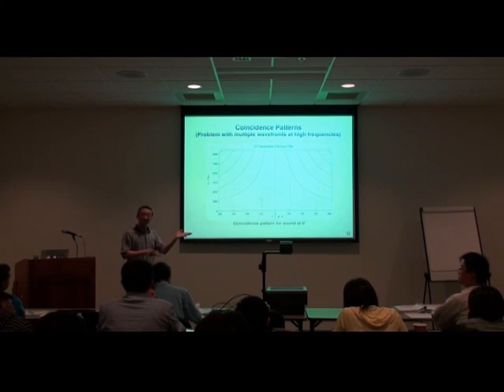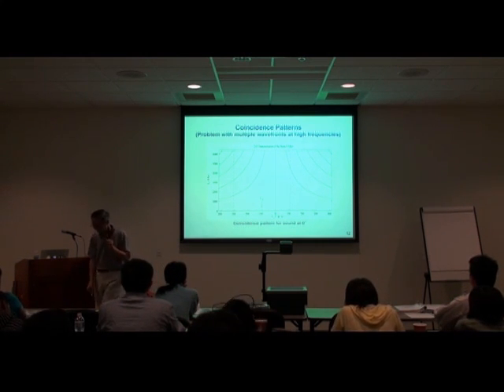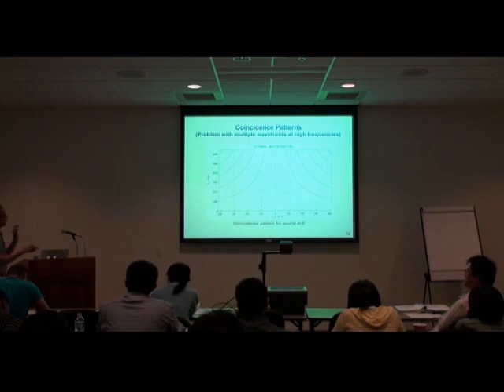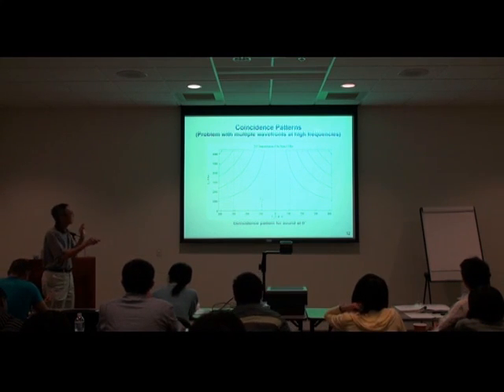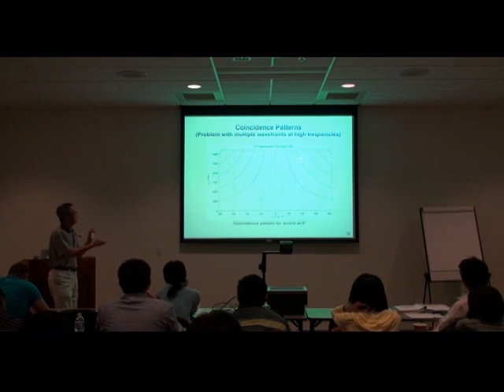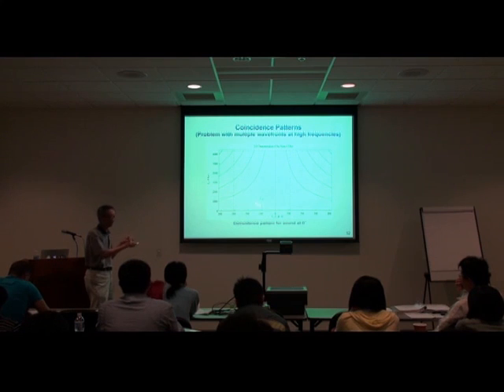We can develop the stencil pattern for every single location: 5 degrees, 10 degrees, 11 degrees, 12 degrees, etc. So instead of letting the ambiguity patterns, because of the higher frequency and shorter wavelength, detract from localization, we actually use this information to help us extract the direction information, to remove the ambiguity.